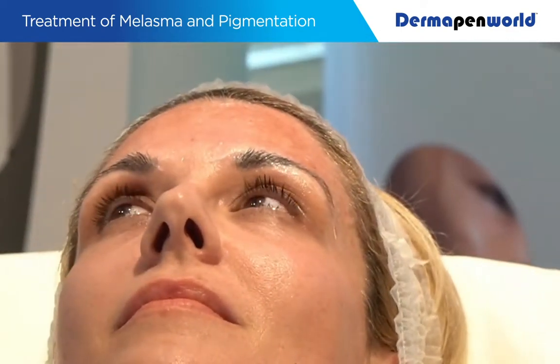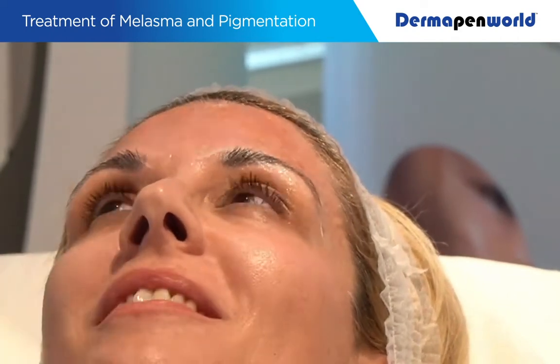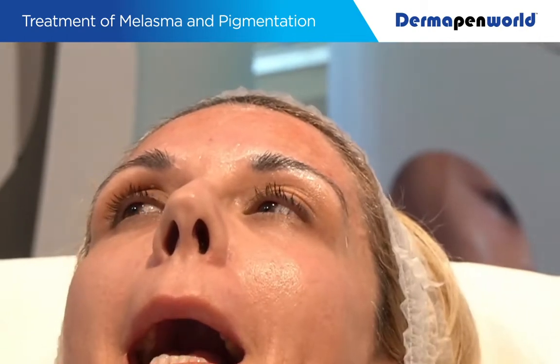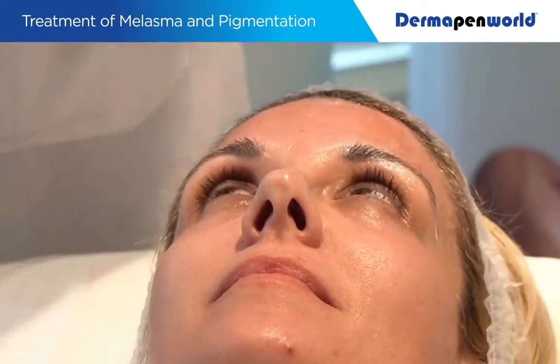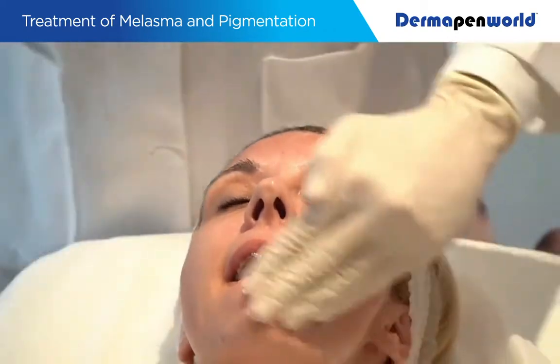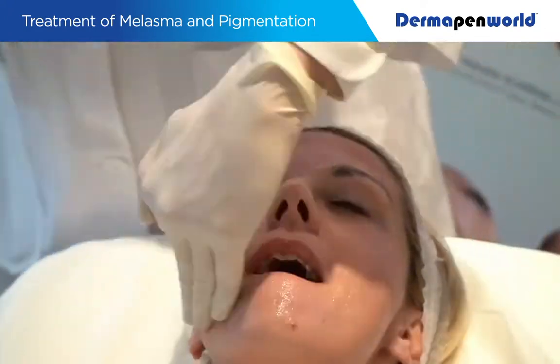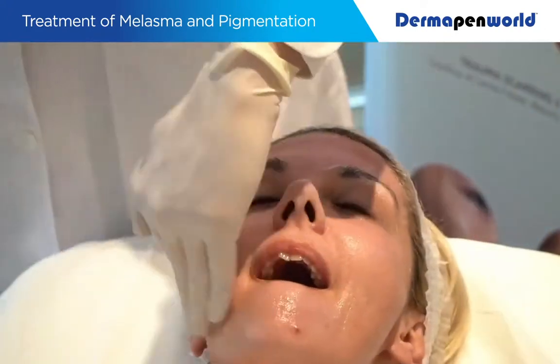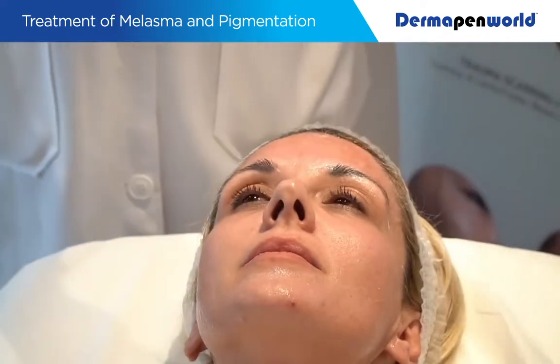Okay, I'm going to hold it on a lip over here like this. If you can do this. So, bottom lip. Okay, over your teeth. Perfect, no tongue. So that flattens out perfectly, so if I work down, the patient does all the gymnastics for me. So, for this patient, 1 millimeter should get some blood coming through. So 0.8 should get us the occasional pinpoint blood. So this is at twice the depth of what was in the forehead. But remember, focus on what you get visually, not what the mathematics is.